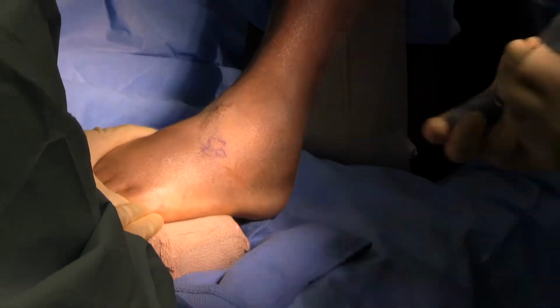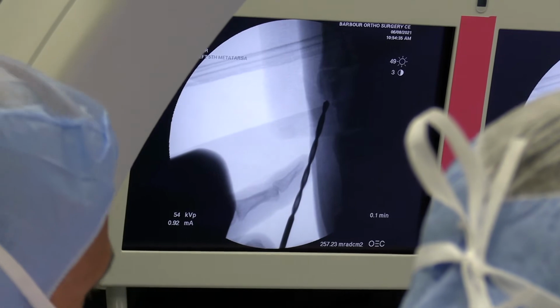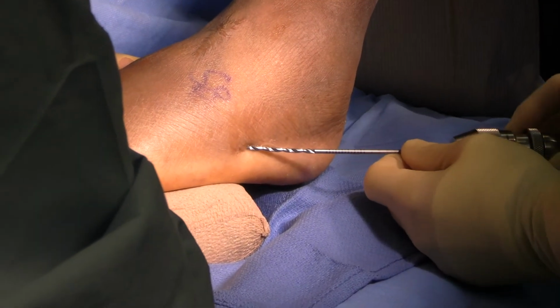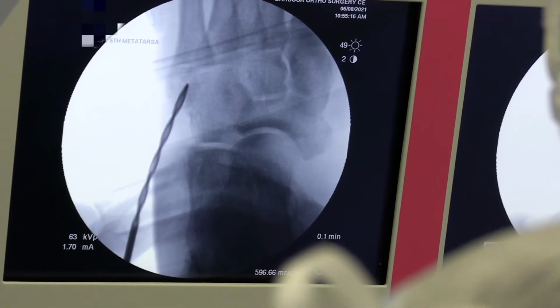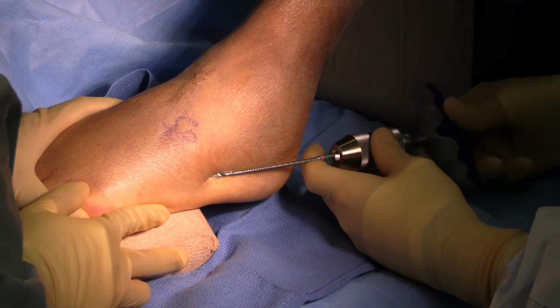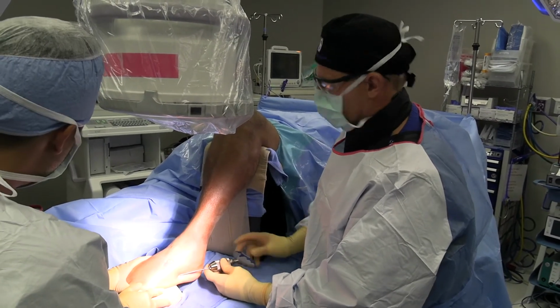You take the screw. This is just a drill bit. And I'm just trying to wiggle my way into the bone with the drill bit. Okay, and the great thing about using this drill bit rather than using a K-wire is that once my drill bit gets on the inside of the bone, it tends to stay on the inside of the bone. So now I've drilled my way in.